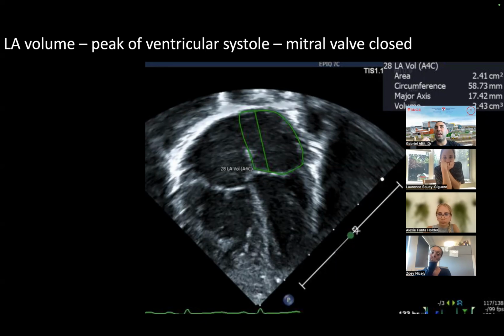So sometimes in these patients where I have hypertrophy, I don't know what's worse or what's better, but I'm less concerned when I have this kind of PDA physiology that can help stent my left ventricle and provide that degree of filling to the LV without leading to LVOT obstruction because of the hypertrophy. So that's one thing to keep in mind.